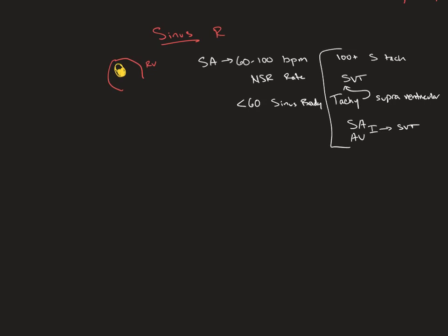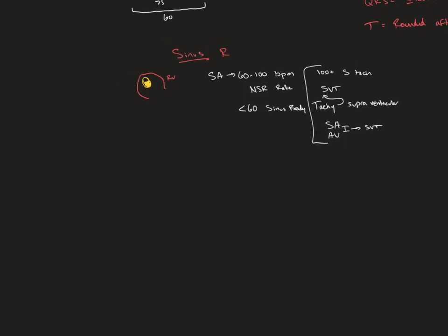And this is when you fulfill these requirements because you could have Mobitz blocks and Wenckebach blocks that have a normal appearing P wave, but the PRI varies, or you have intermittent non-conduction, which is going to give you a second degree block, type 2 and type 1.